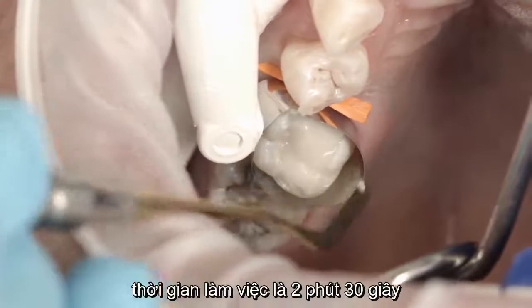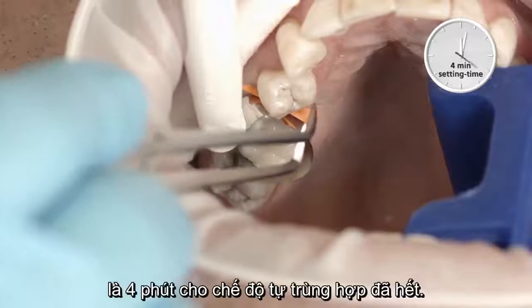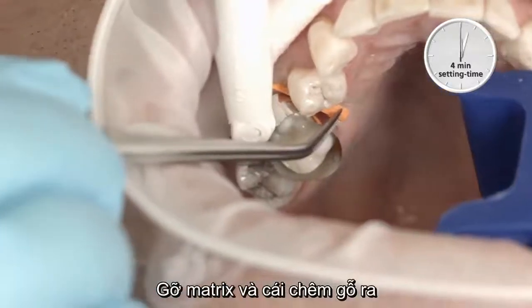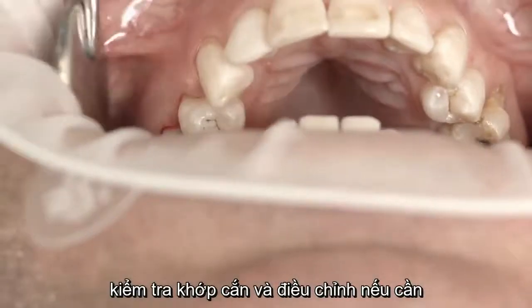The working time is 2 minutes and 30 seconds. Once the setting time of 4 minutes for the self-curing mode is reached, remove the matrix and wooden wedges. Check the occlusion and adjust as necessary.